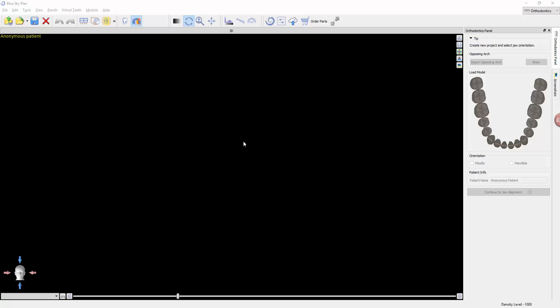The purpose of the following series of videos is to introduce you to the software and the various phases of the orthodontic module within the Blue Sky Plan software.